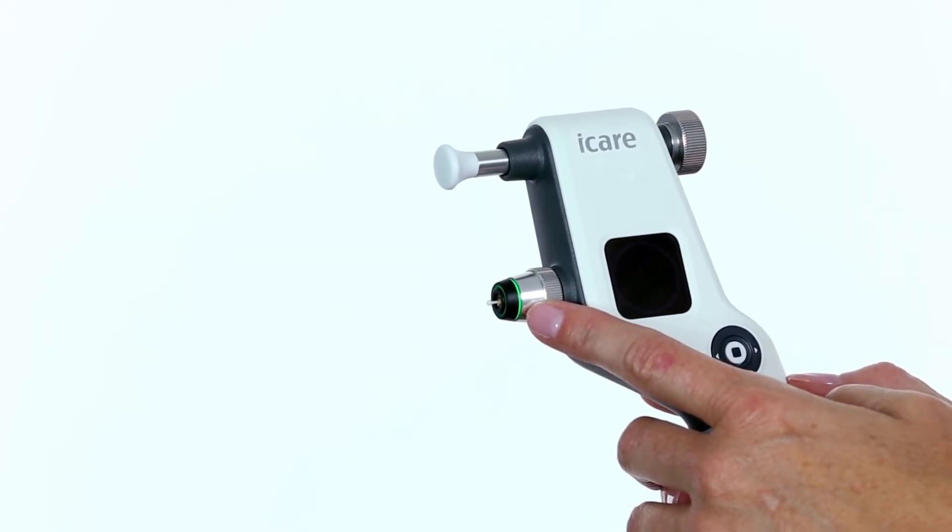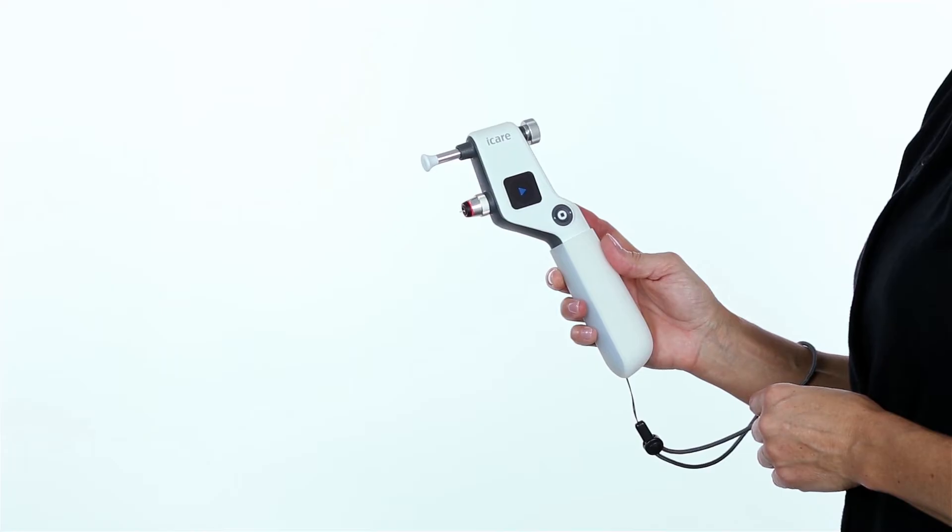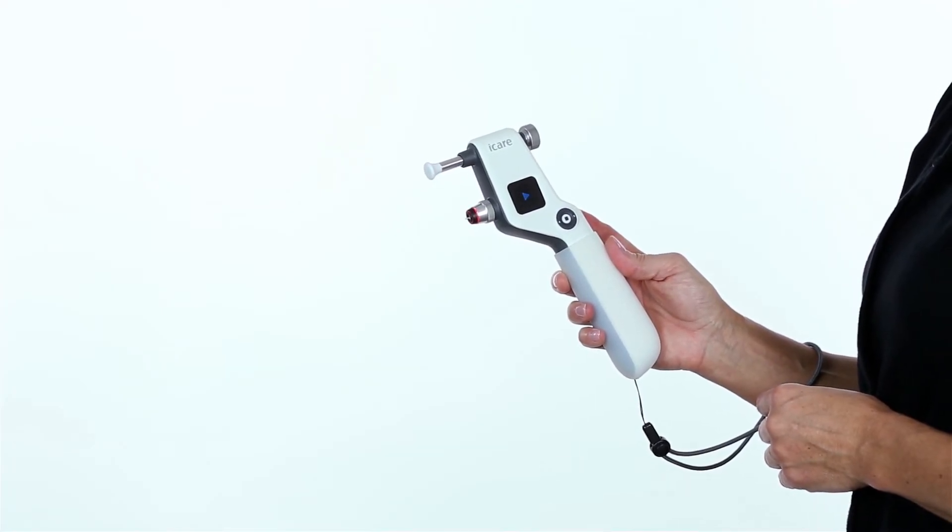The green probe base light indicates proper alignment. If the probe base light is red, the alignment is incorrect.